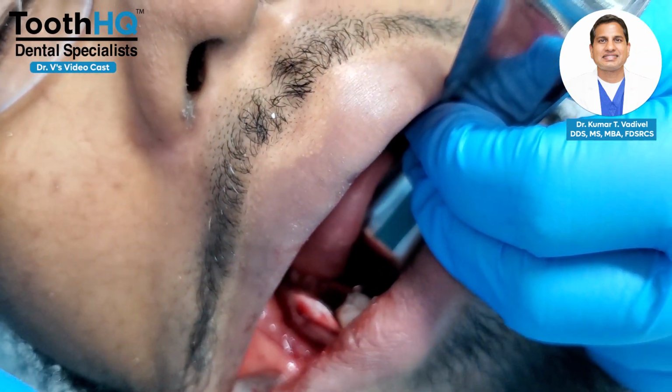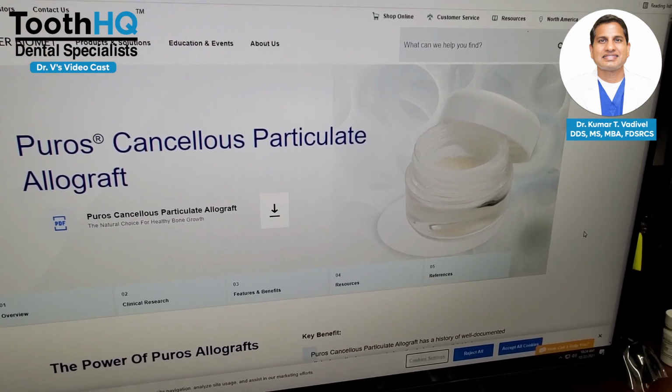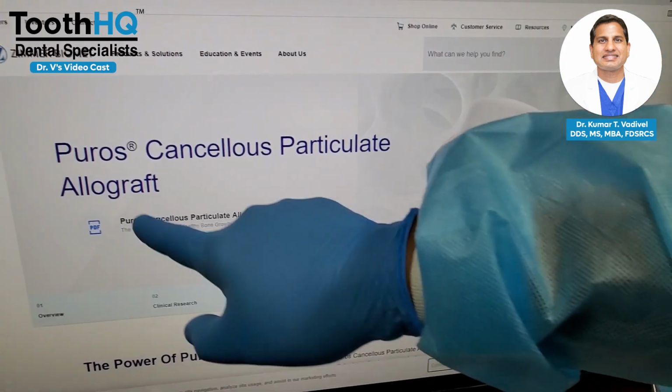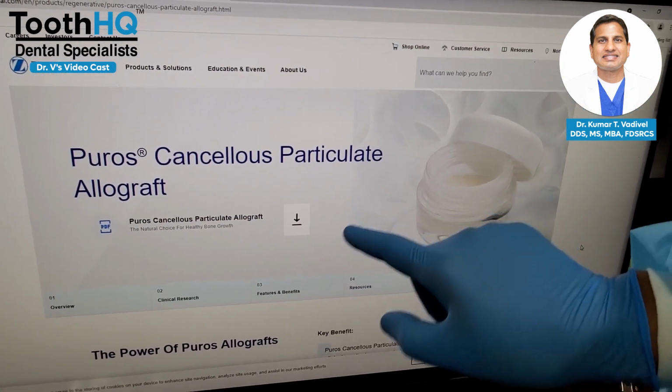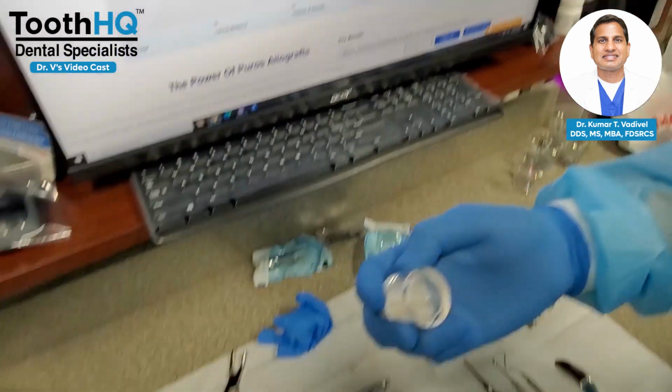Okay. So you guys already saw me putting in the membrane there. So now I'm ready for the bone graft. Now we are going to be using the Puros cancellous particulate allograft, and it comes in a vial like this, and this is what I have here.